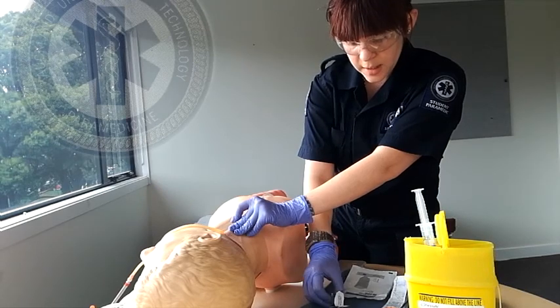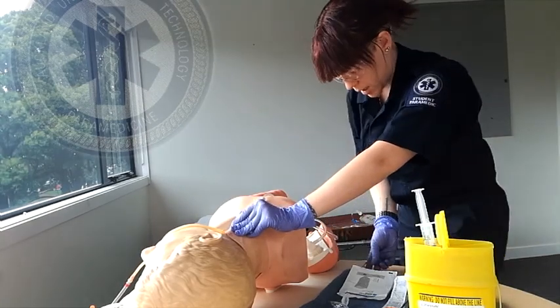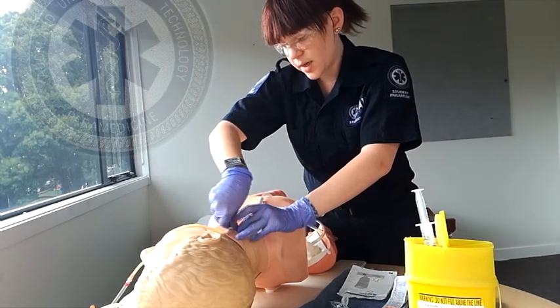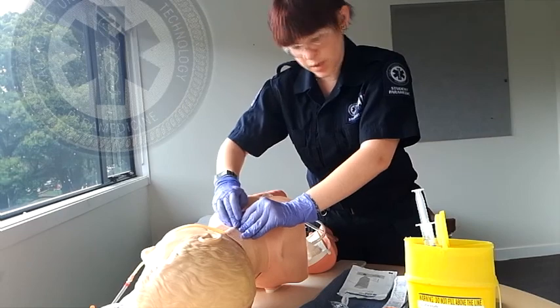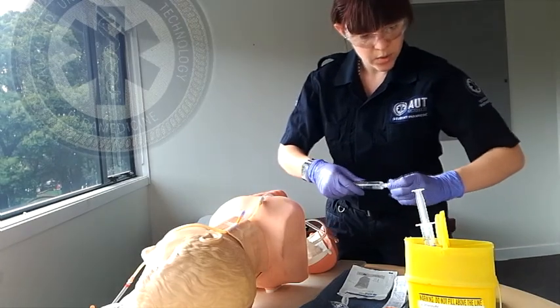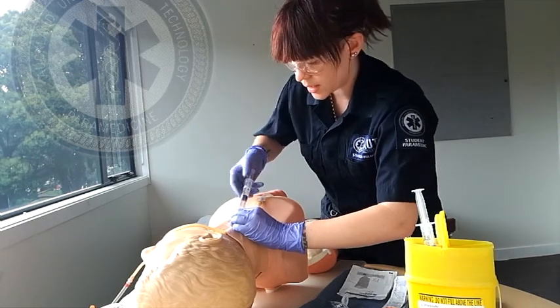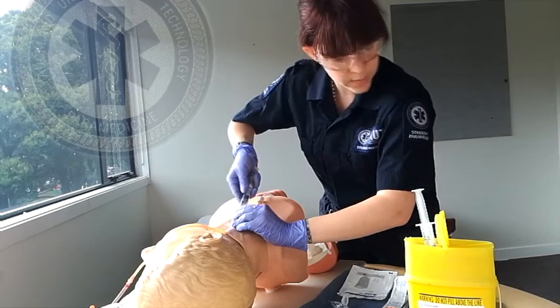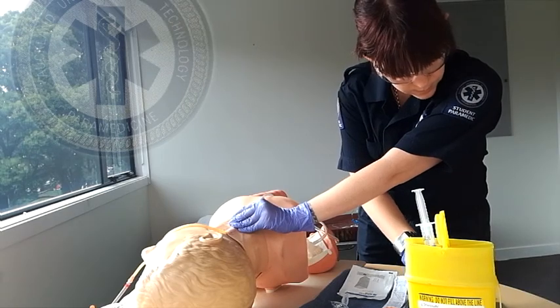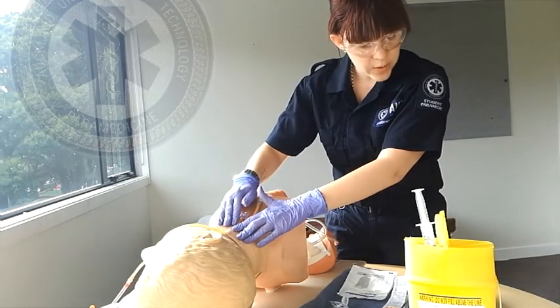I'm going to apply the luer plug and then secure it with some tape, because the risk of movement in this area is much higher than with a regular IV cannulation. I've got that tape there. I'm now going to flush with the saline just to check for patency on the line. There's no resistance to that flush, so I'm quite happy with it. There's no swelling, so there's no tissue infiltration from the fluid.